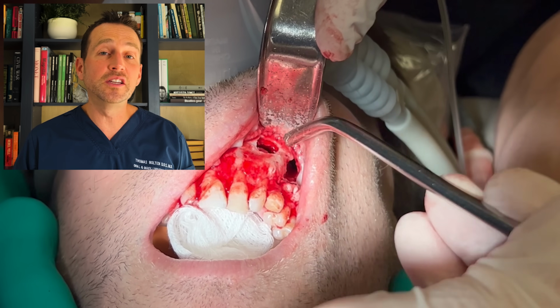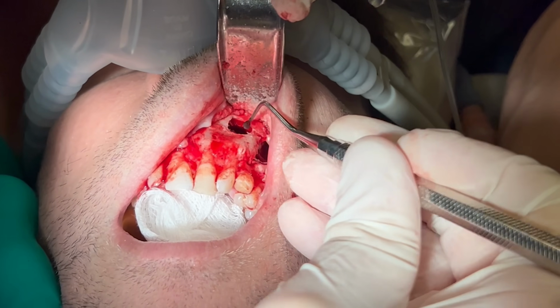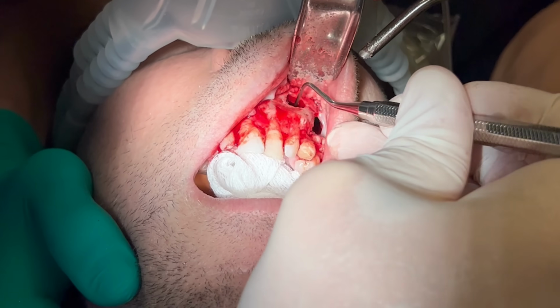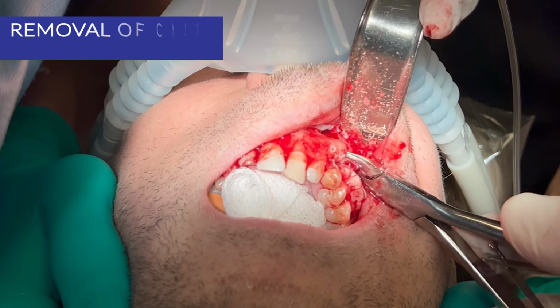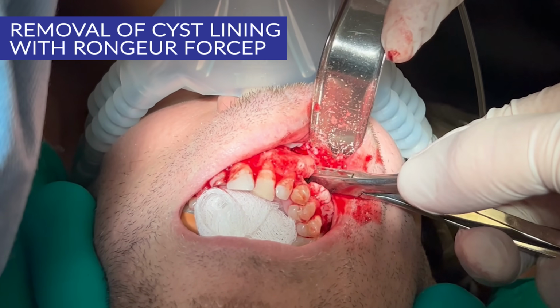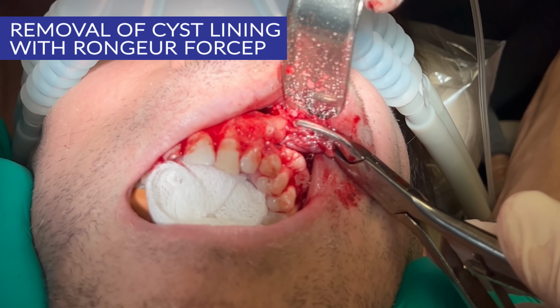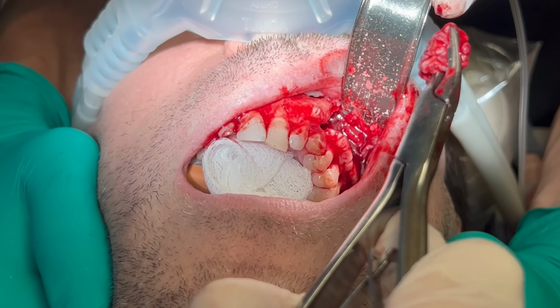Now I have access and I begin to curette the lining off the bone. Here is the majority of this growth.